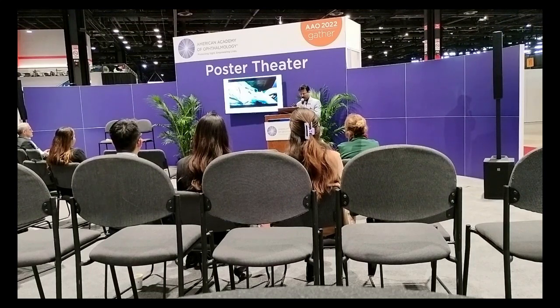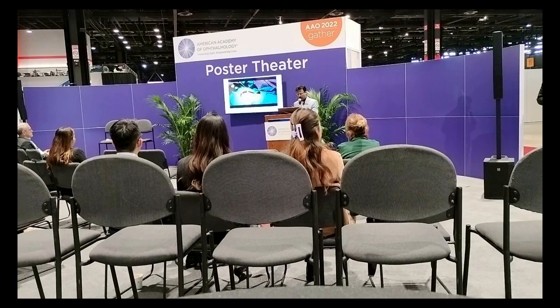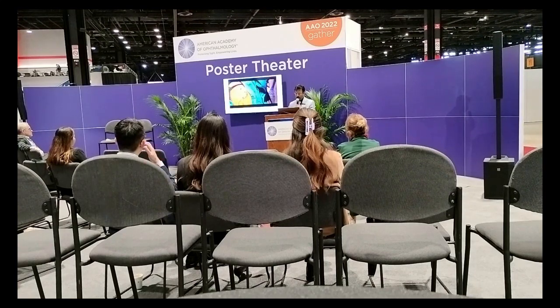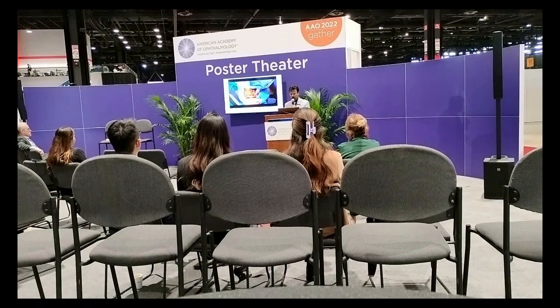Now the balloon is inflated again for 3 days. On the 4th day, deflate the balloon and make an ellipsoid area of skin defect where all the scar is removed. As this ellipsoid area is created, the lower eyelid bulge goes up, so the MRD2 value will be reduced, and full thickness skin grafting is done. The skin is harvested from the medial surface of the arm. This is the full skin grafting done.